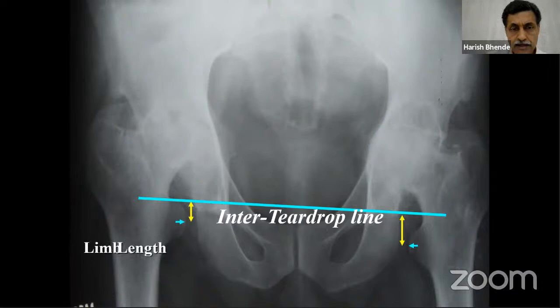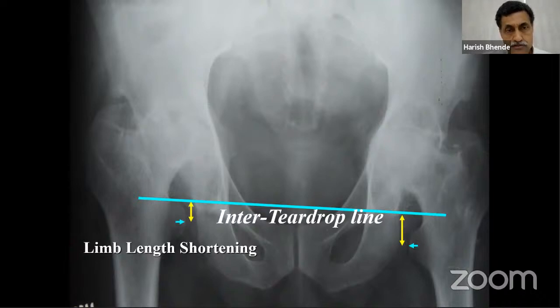Now this is your limb length discrepancy, which is the actual limb length discrepancy you have to correct. A patient's leg may appear shorter than it is because of an adduction deformity on that side, in which case you should not over lengthen the leg. This gives you the exact amount of bone shortening, and that much lengthening you need to do on the table during surgery.